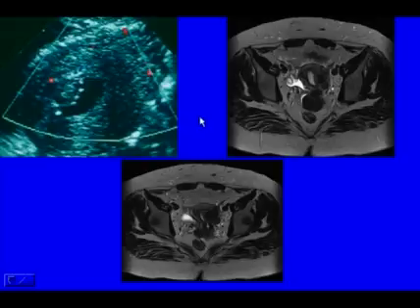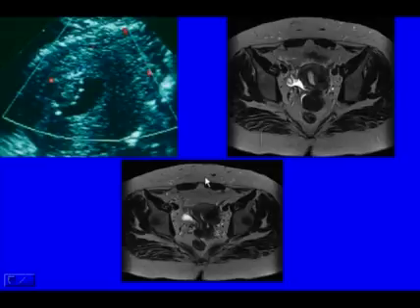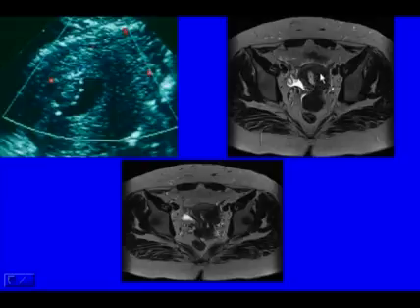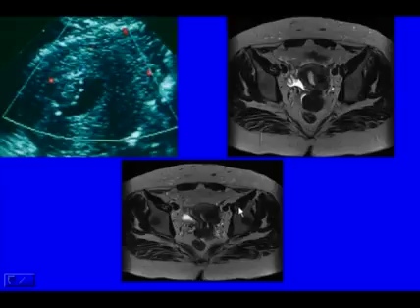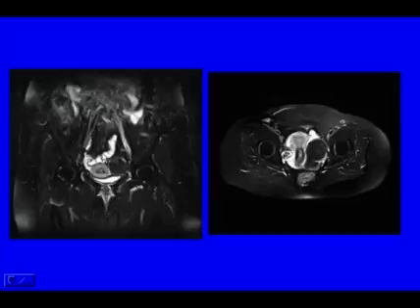MRI can be helpful in these patients, though in most cases diagnosis can be made with transvaginal ultrasound, sonohysterogram, and 3D acquisition coronal imaging. An MRI view nicely shows a fibroid displacing the endometrial cavity. Another MRI coronal view shows the relationship of a pedunculated fibroid to the uterus.